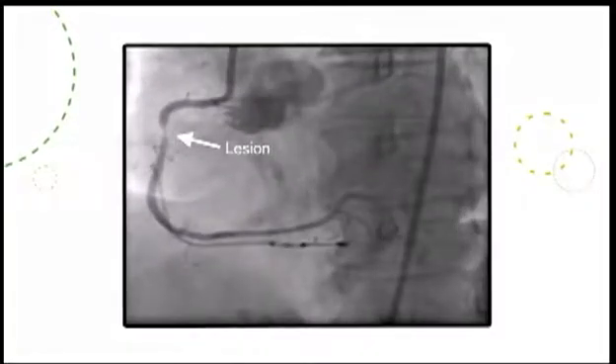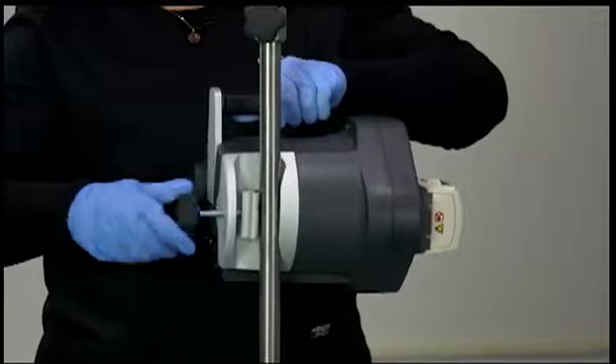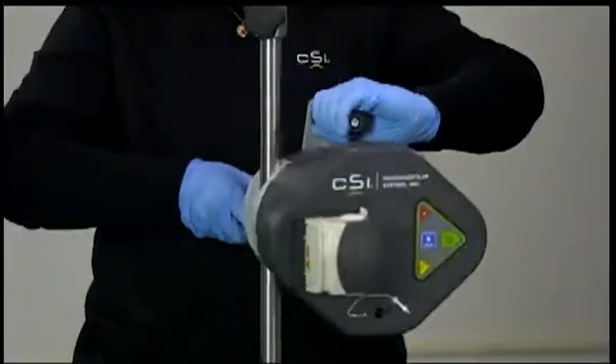Gain vessel access using the physician's preferred methodology. Use angiography to visualize and evaluate the lesion. The setup takes less than two minutes. Use the screw clamp to attach the pump to a standard IV pole, no higher than 60 inches (153 centimeters) from the floor.